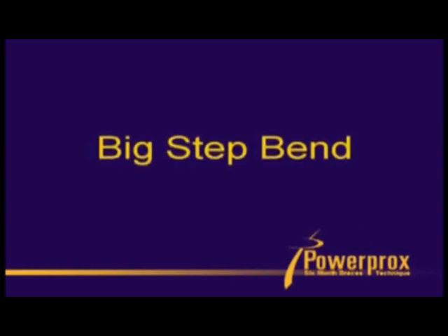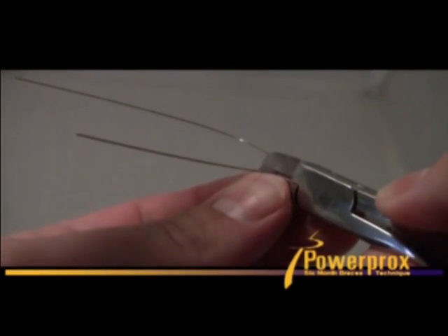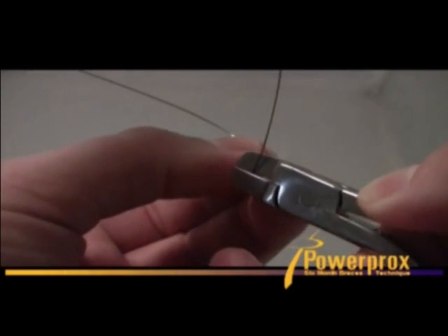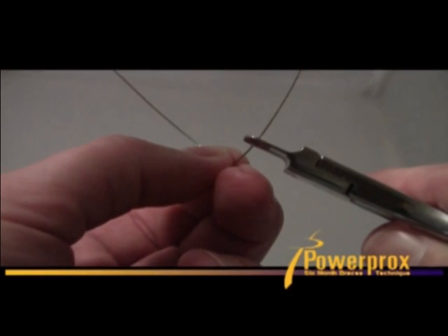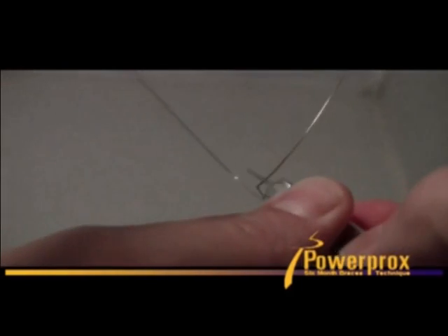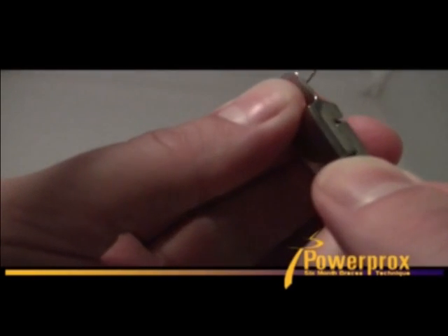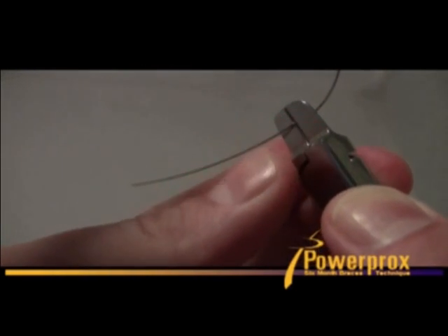And here's just a video that's going to show the big step bend in action. Now I like to use the ribbon arch plier, grab the wire in the place you want the bend to be, and use your thumb to bend as close to 90 degrees as you can. Then you only need this generally to be a few millimeters, just enough for that cusp tip not to collide with the wire. Place it again, and then bend another 90-degree bend with your thumb against the plier beak.